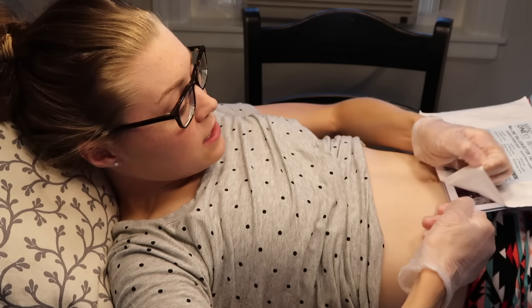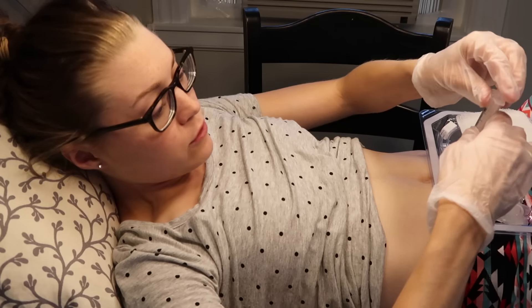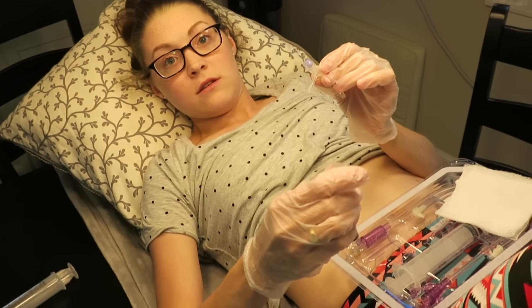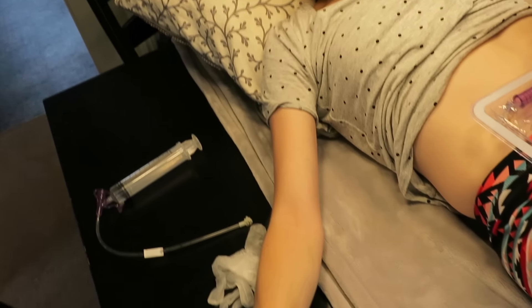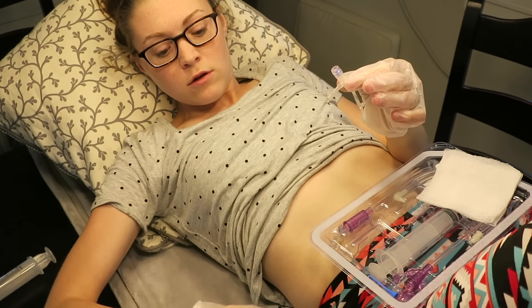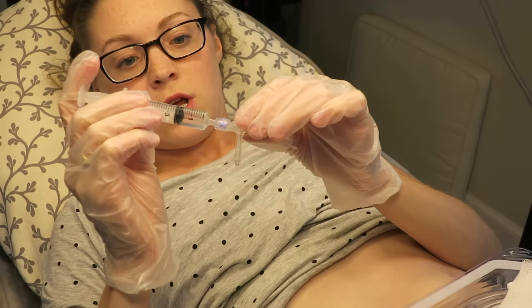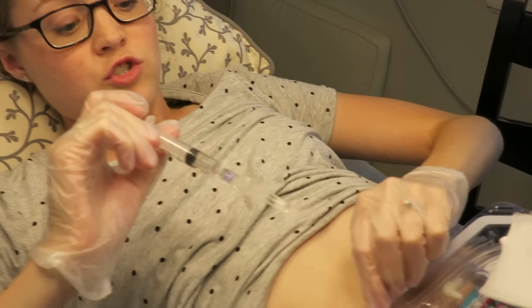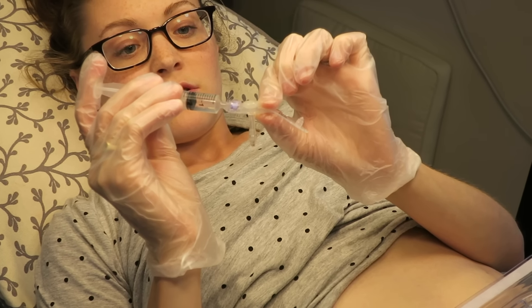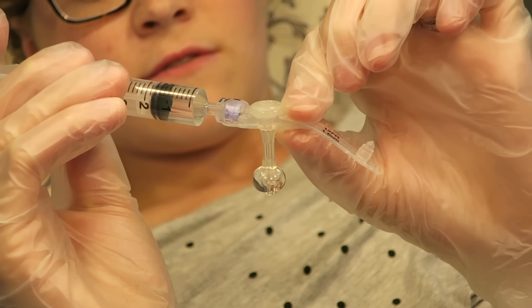Alright, I'm gonna open this surgical tray and grab the balloon filler rubber syringe. I'm gonna test this new balloon and make sure it's functioning. I'm gonna get some distilled water into my syringe and get the air out. I have two mLs in my syringe and I'm just gonna test the new balloon. So this is what's gonna go inside of my stoma, and here's what the balloon looks like inside — the balloon is just a thing to hold it in place.